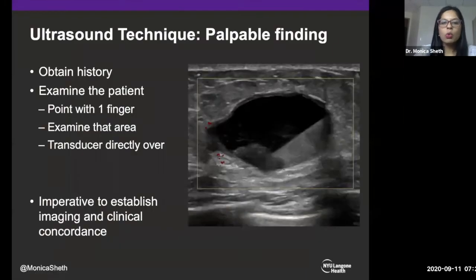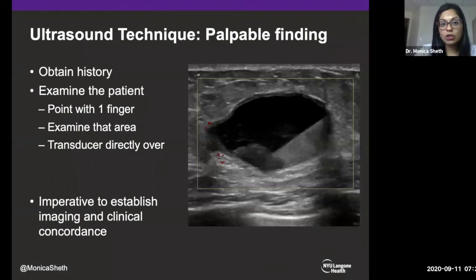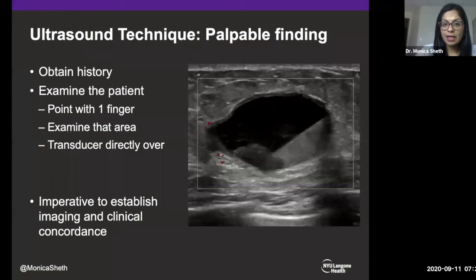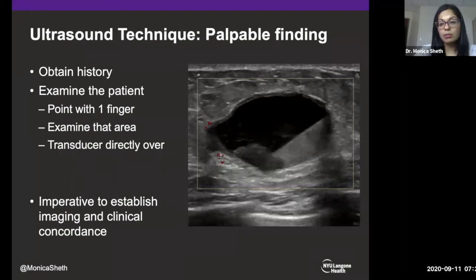An important tip on ultrasound technique: when someone comes in with a palpable finding, obtain history. When you are with the patient, ask them to point with one finger to the area they are feeling. I examine the breast at that location — I want to make sure I can feel what the patient is feeling. I put the ultrasound transducer directly over that spot and take an image. This is critical: you want to make sure you are able to correlate the imaging findings with the physical exam and that you are actually imaging the area of palpable concern. I have found this technique to be very useful during my career.